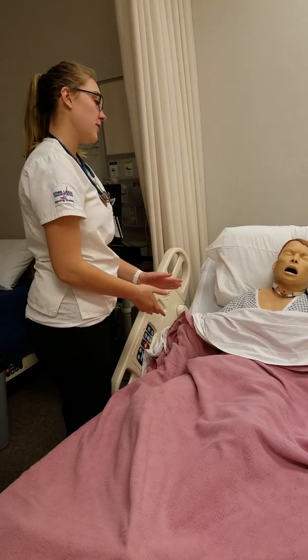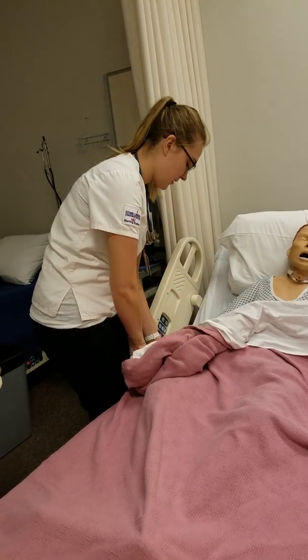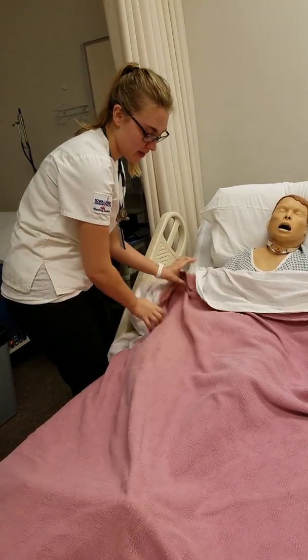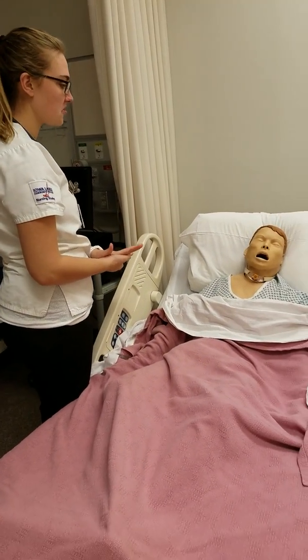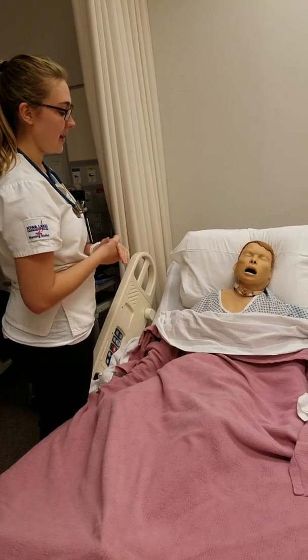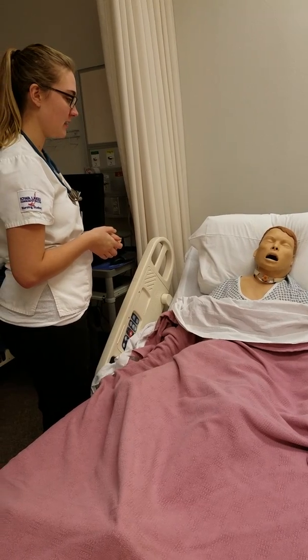And then can you tell me what year it is? Okay, good. Can you squeeze my hand? All right, and I see that the patient can follow instructions. Have you had any nasal surgeries in the past? Have you ever had an NG tube? Okay, you have. When was that? Do you remember what size tube they used or not?